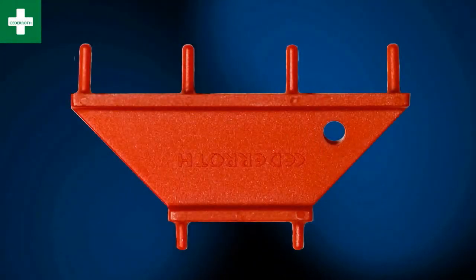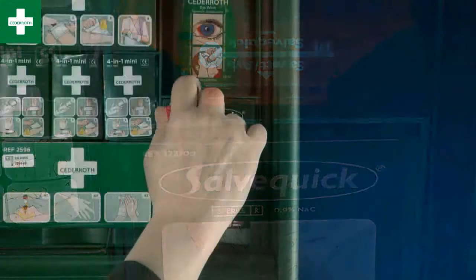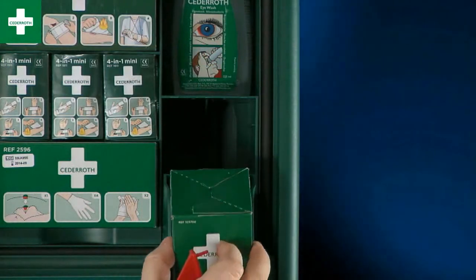Changing the wound cleanser refill: put two pins of the key into the two holes above the wound cleanser holder, press the key down and the holder opens.